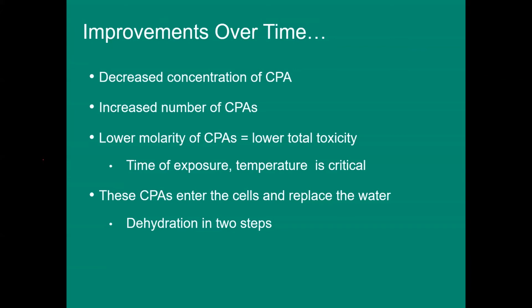We know that the cytotoxicity is mainly related to the concentration of the cryoprotectant, and every cryoprotectant needs a certain cooling rate to be transformed to glass status.